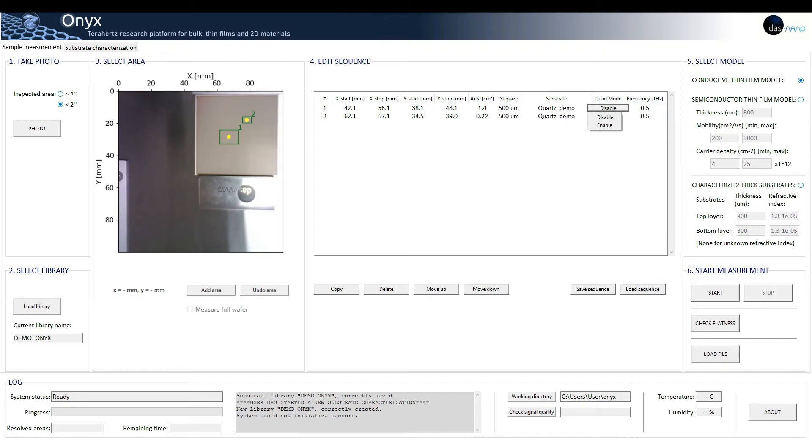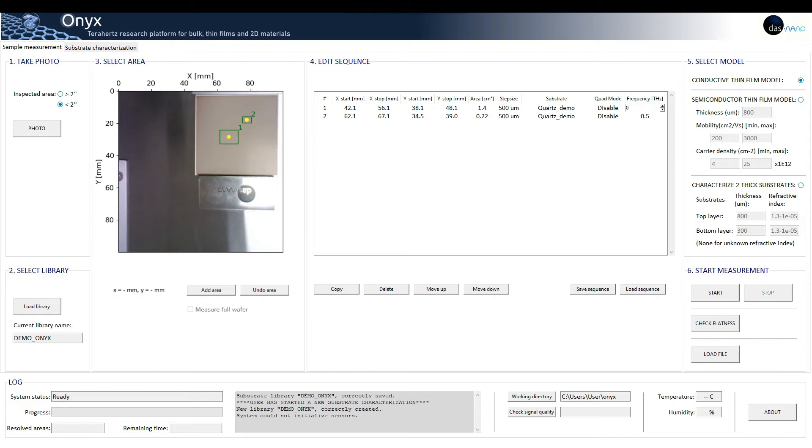We can enable or disable the quad mode, which provides more accurate measurements, and also we can choose the frequency used in the analysis.